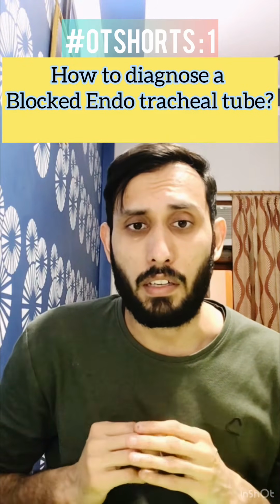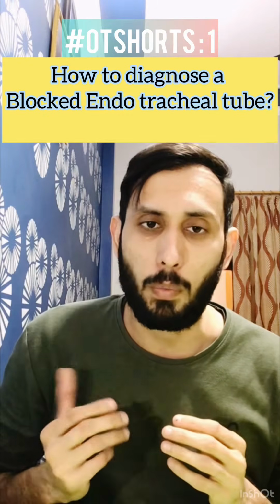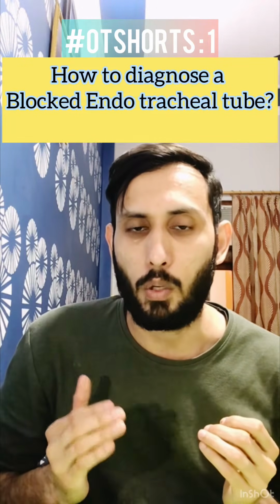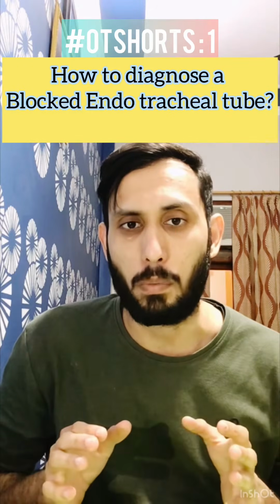It is very rare if there's some foreign body or the tube has got kinked. That may be a different thing, but the tube getting blocked due to secretions is negligible.